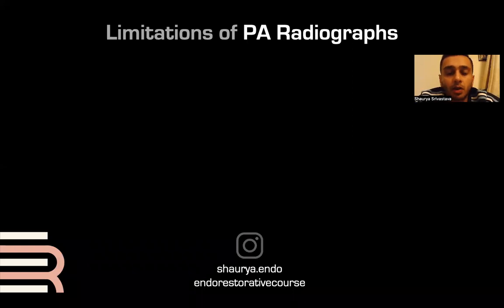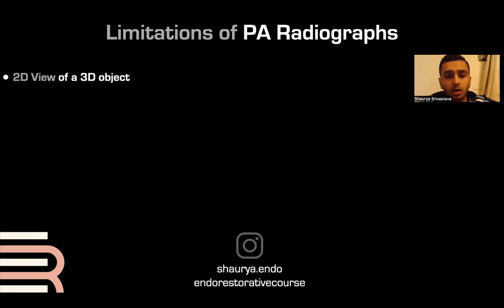Right. So limitations of periapical radiographs, as I already said, and you're going to see over this presentation as well, yes, they are very important. You have to take your periapical radiographs when you're doing your case assessment, when you want to do your treatments. They have their place and they're irreplaceable. But they have their limitations. As we know, it's a 2D view of a 3D object. No matter what technique you use, bisecting angle, parallel technique, it's going to be a 2D view of a 3D object. Okay, your 3D, this only shows you a 2D plane of it.